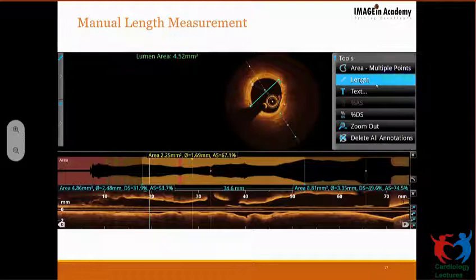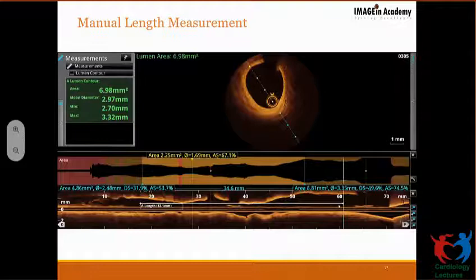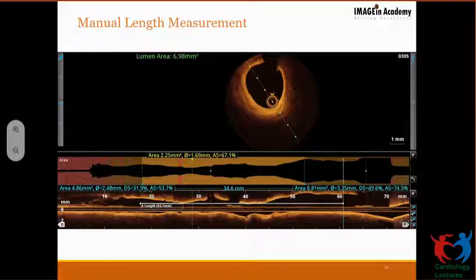I can also measure the length of the stent, because I put my markers for the proximal and distal reference. So this is how I measure the length of the stent which is to be implanted. In this given case, I measured 43, so maybe I'll select a 48 millimeter stent for addressing this vessel. It's as simple as this.